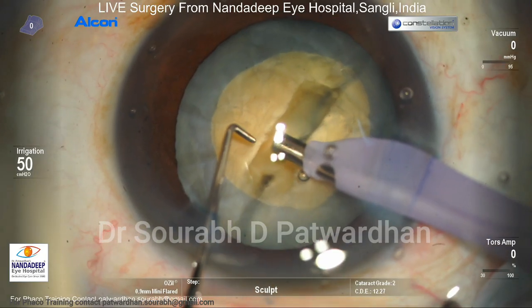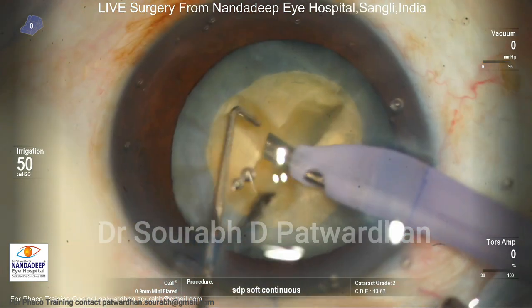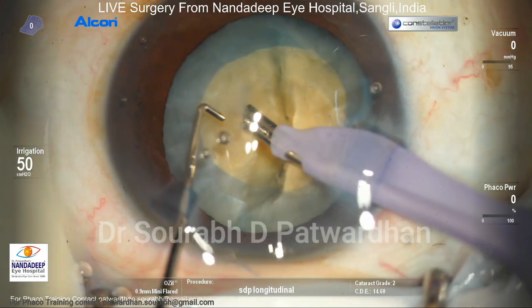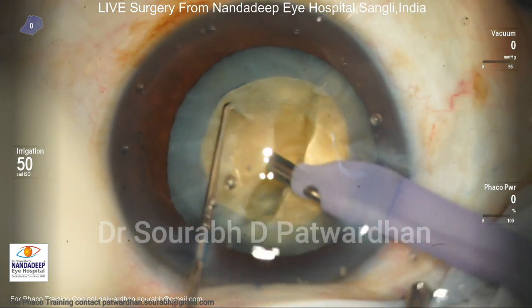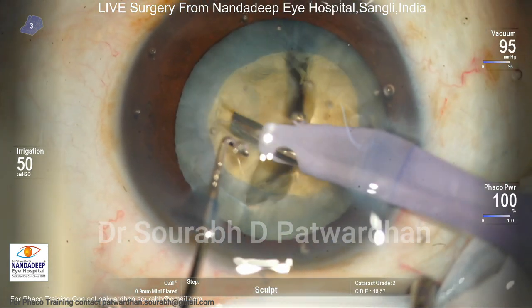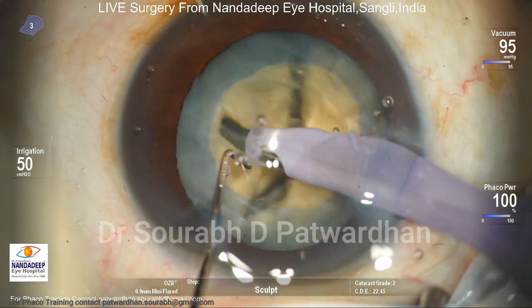So why does this happen? I did an experiment. On one side, I am using 100% torsional FACO, and you can see how I can easily cut this nucleus while trenching. It almost cuts like butter. On the second half, I use 100% longitudinal power for trenching, and you can see that with 100% longitudinal, I can do good trenching. But you can definitely see that with torsional, the trenching is very, very easy.